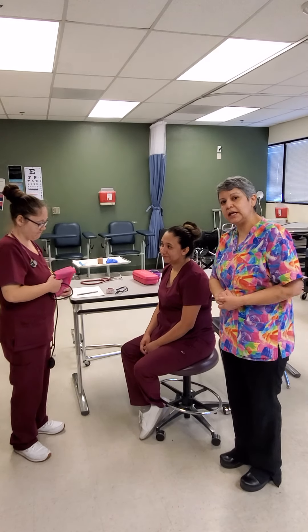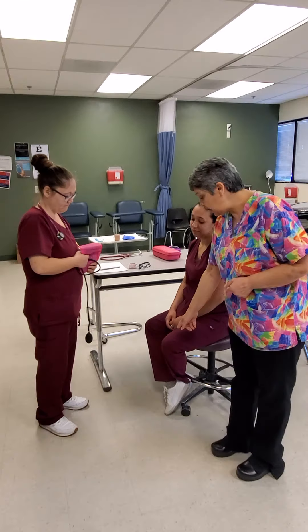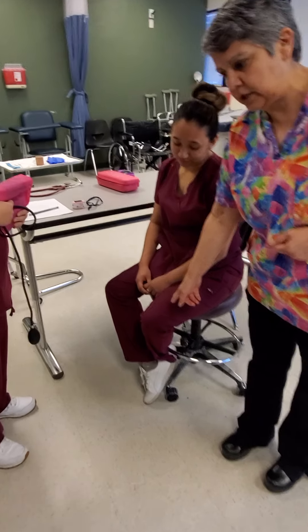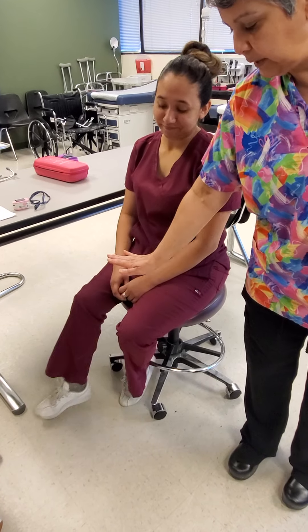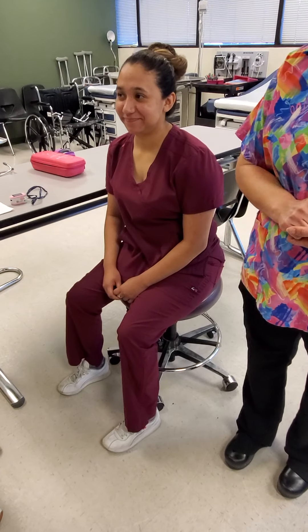Jasleen has her legs crossed. We do not want our patients to have their legs crossed — it cuts off that flow. So we're going to ask her to please place her feet flat on the ground or on the floor.